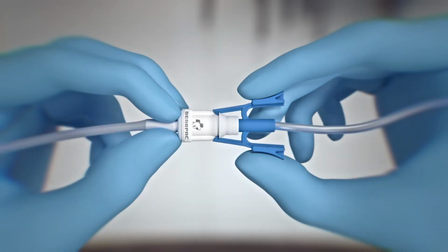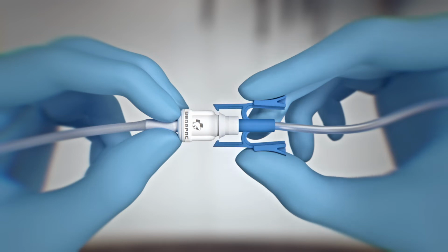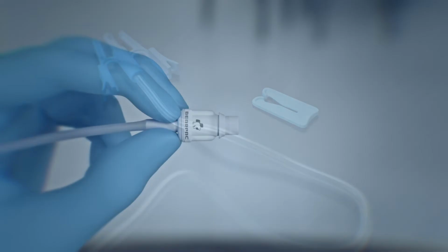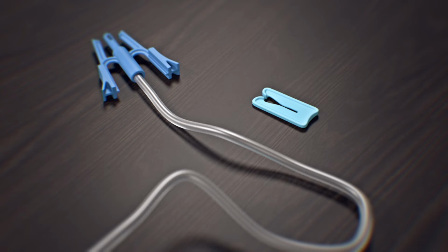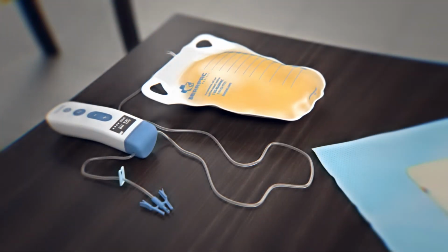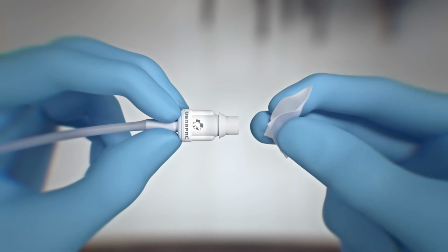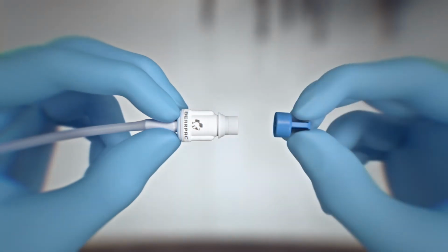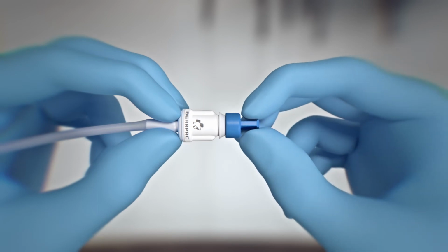Disconnect the drainage line by holding the catheter valve firmly with one hand and squeezing both sides of the catheter connector clip with your other hand. This will allow the catheter connector clip to separate from the catheter valve. Clamp off the collection bag tubing with the blue clamp from the redressing kit to prevent any fluid leakage, and set the drainage collection system aside. Wipe the catheter valve with a new alcohol pad and place a new catheter valve cap onto the catheter valve.